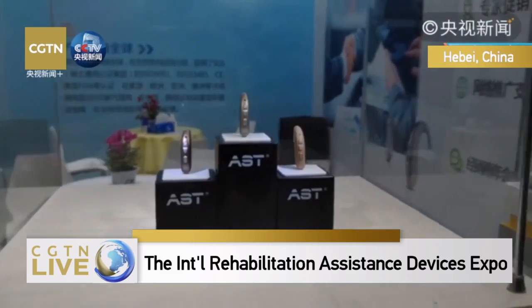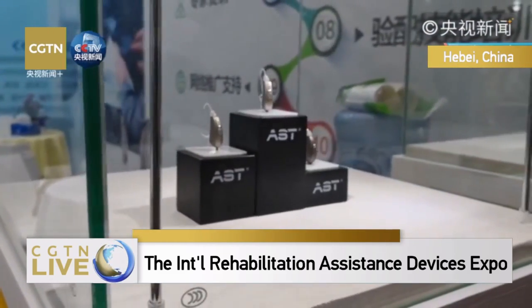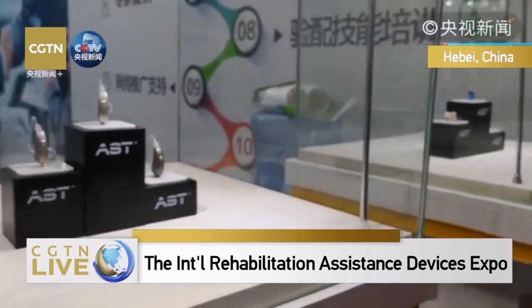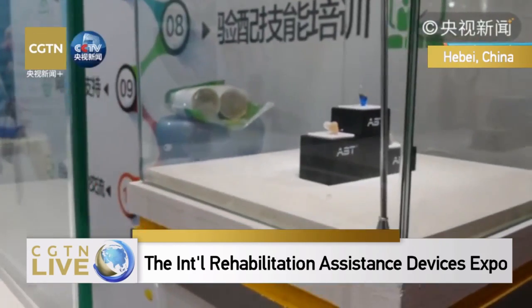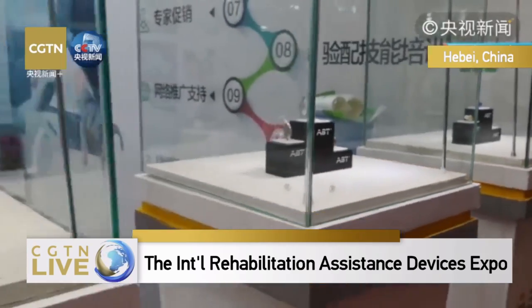It's another category in the 12 categories that I mentioned. This is hearing aid. Very small hearing aid.